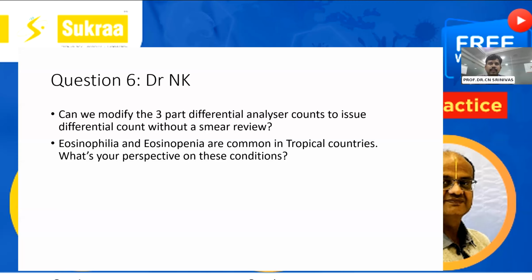As we know now, this classification based on size may not be completely accurate, and there are many times in which there can be inaccurate categorization, and there is potential to miss blast cells or atypical cells. And if there is any size variation in common cells like neutrophils, they may be wrongly classified.